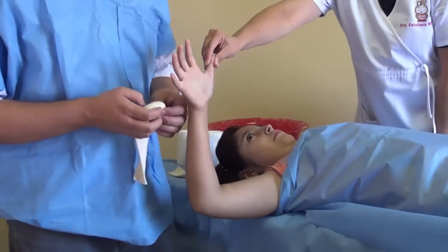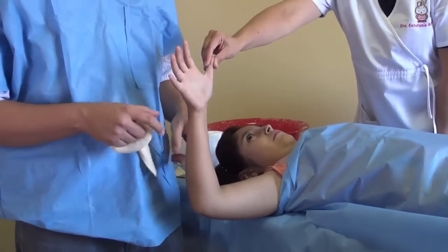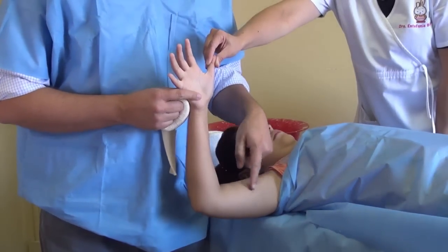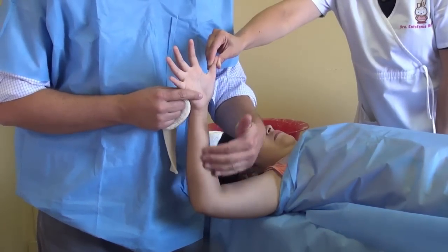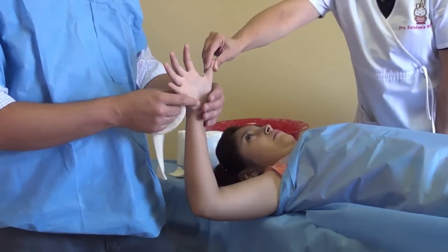Now we're going to start doing our cast. First of all, make sure the position of the arm is the right position. We're going to put the cast with 90° flexion of the elbow and the wrist straight.